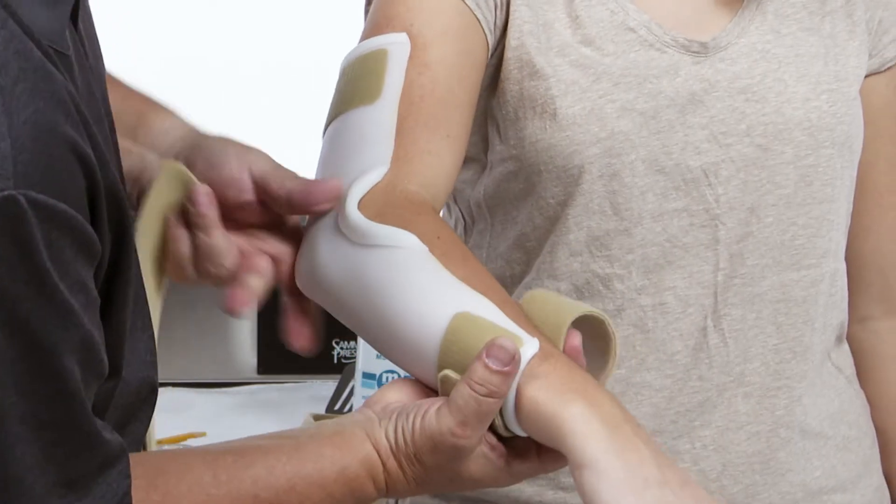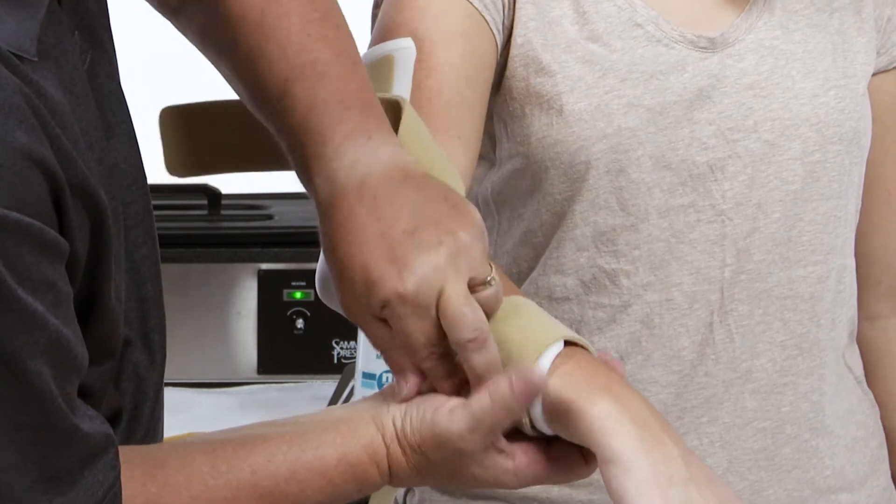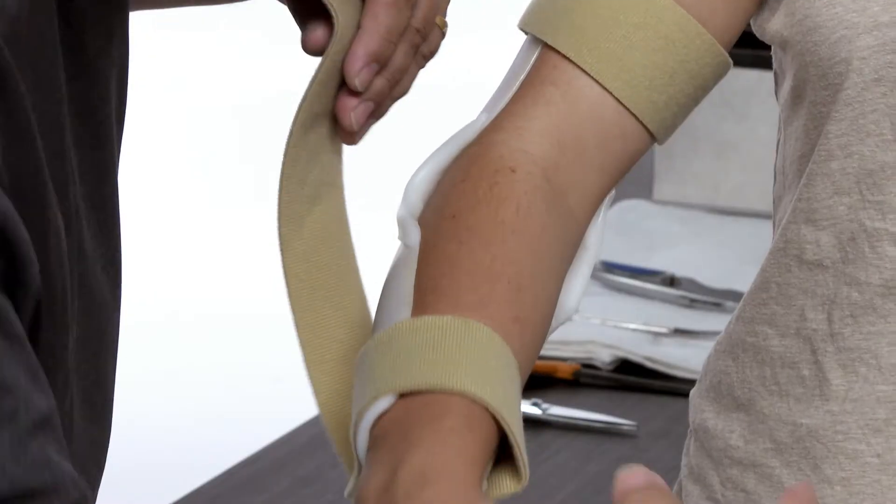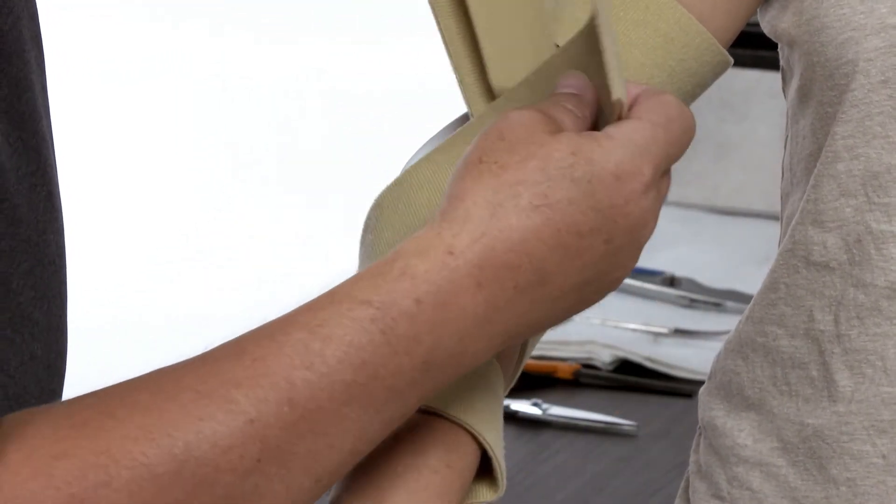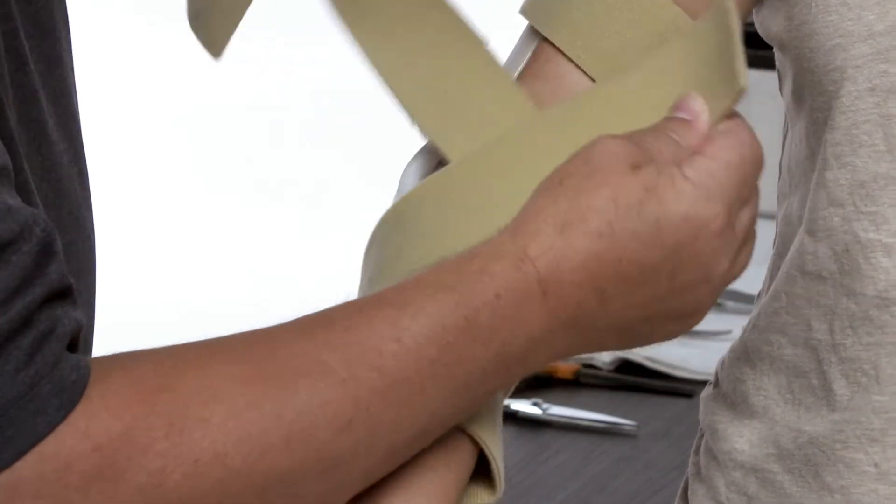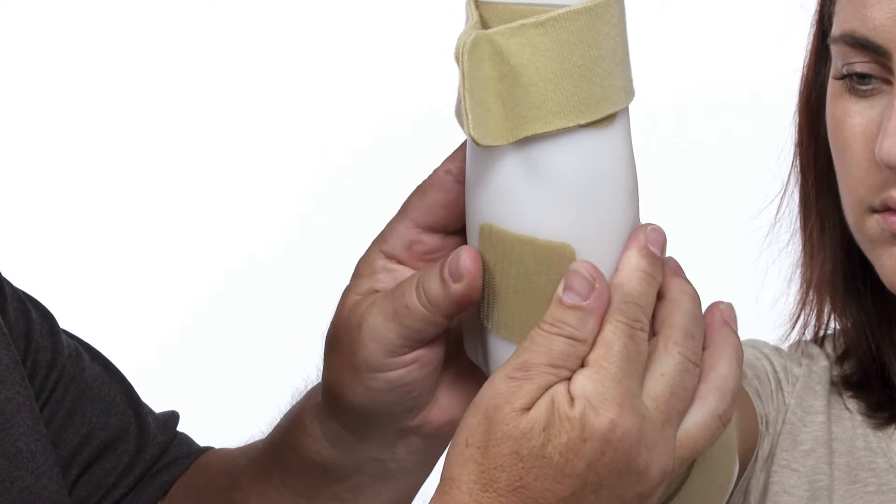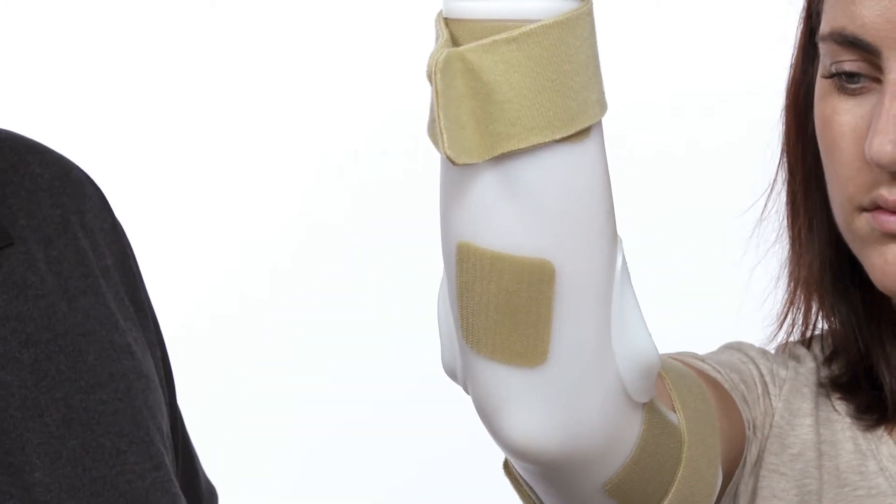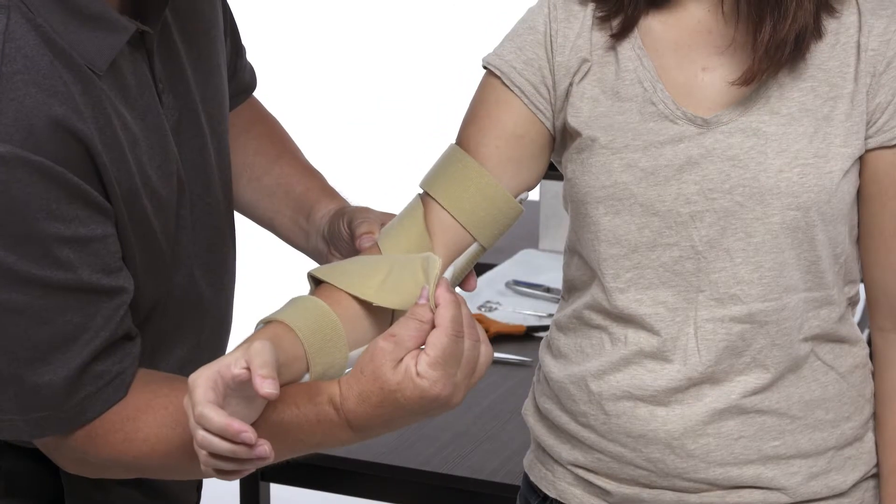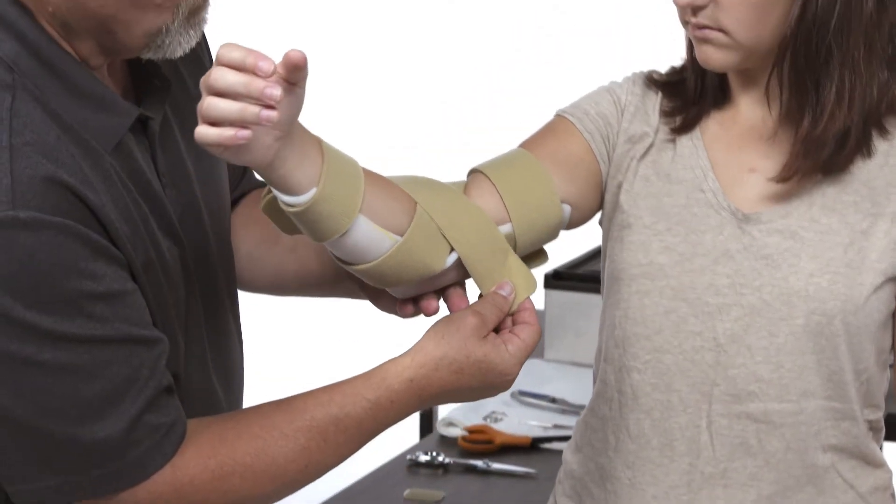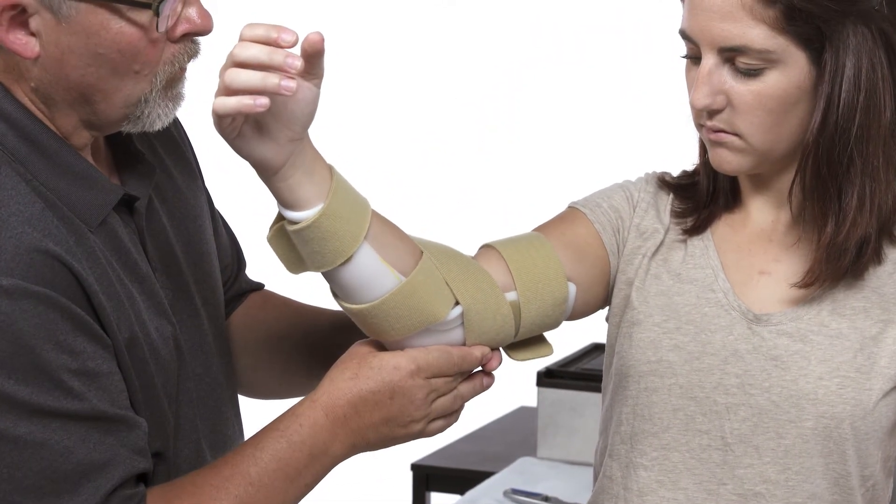Place three straps on the splint. One distal, one proximal and a crossing strap over the elbow. Shimmy the strap up the splint and arm until it organically fits in place. Then apply the third velcro hook where the cross strap sits under the splint. Fit the cross strap in place and check that the straps aren't impinging the patient's arm.